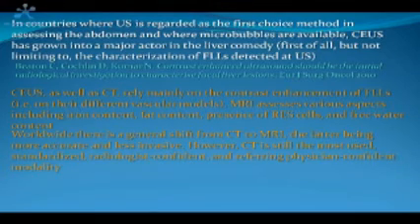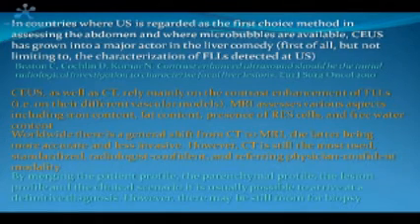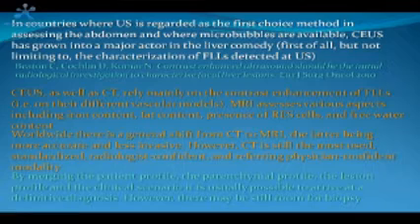And consequently, worldwide, there is a growing shift from CT to MRI, but CT is still, at least in Italy, the most diffuse, standardized and confident imaging modality to study the liver.